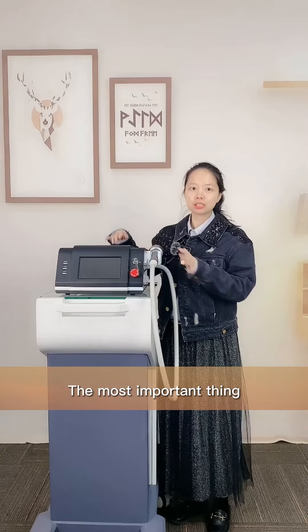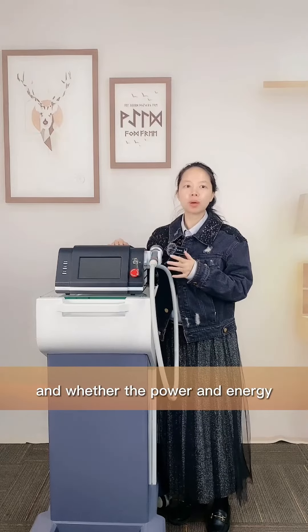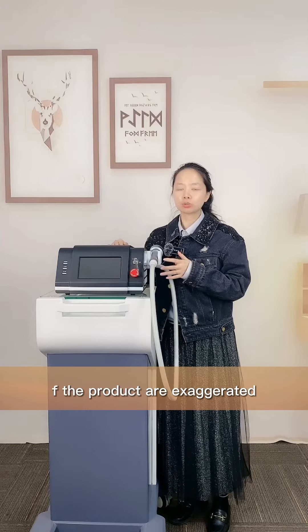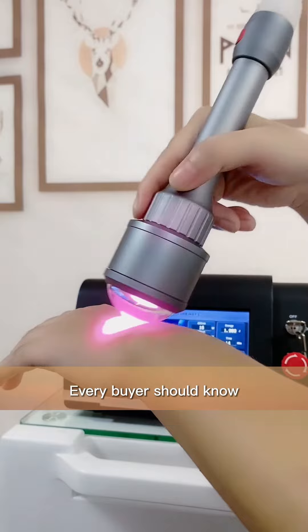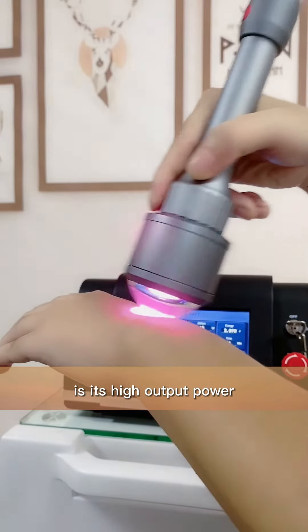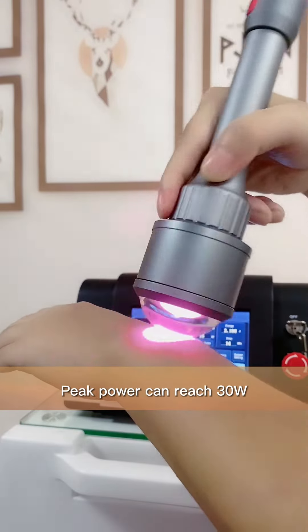The most important thing about the product performance is whether the power and the energy of the product are exaggerated. Take our smart S30B as an example. Every buyer should know the main advantage of our smart S30B is its high output power — its peak power can reach 30 watts.